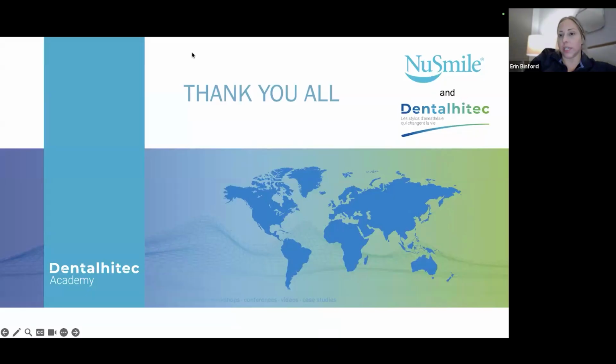The IFU is technically up to 14. And again, that's because of manual bone penetration. That is not actual delivery of local anesthetic. Yeah, that's exactly right, Josh.